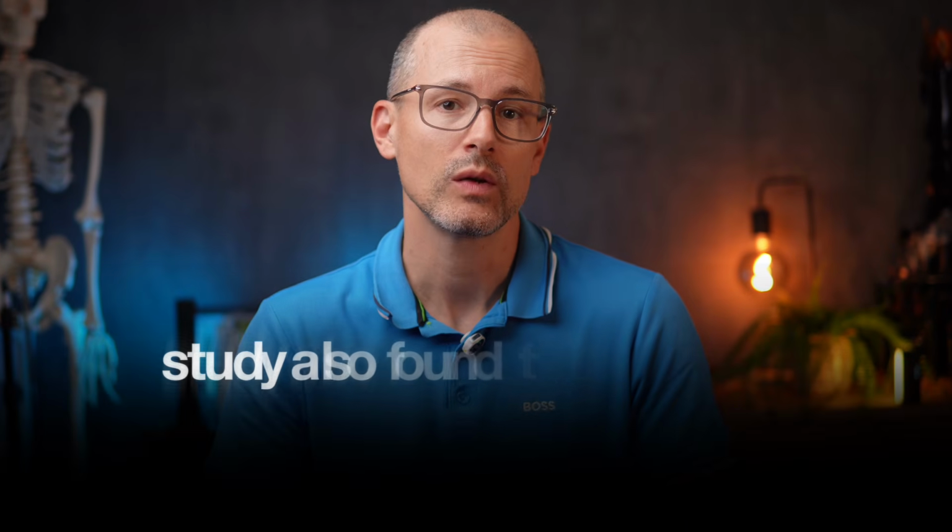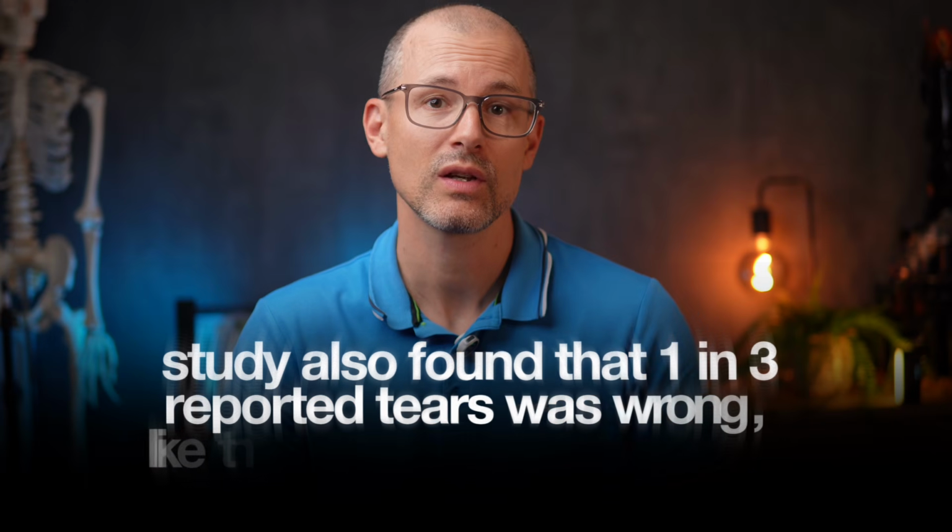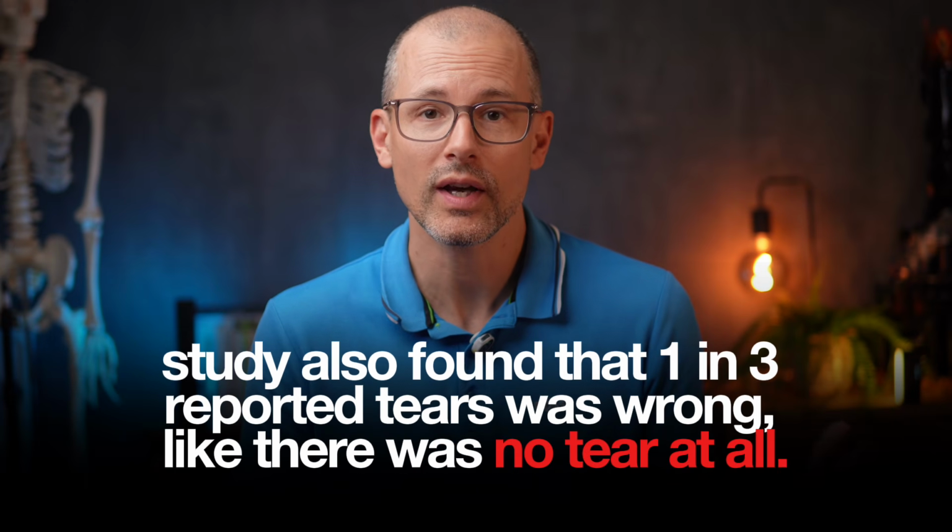The study also found that 1 in 3 reported tears was wrong, like there was no tear at all. These false positives can lead to unnecessary surgery and an angry surgeon. And we don't want that, right?